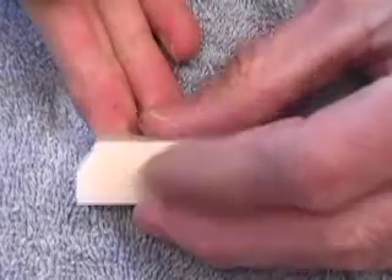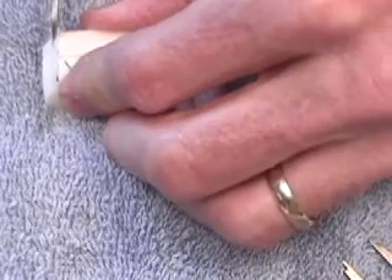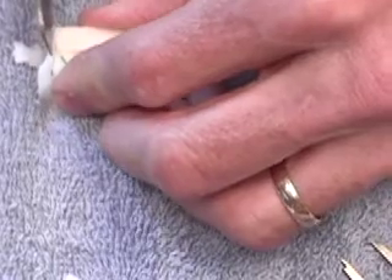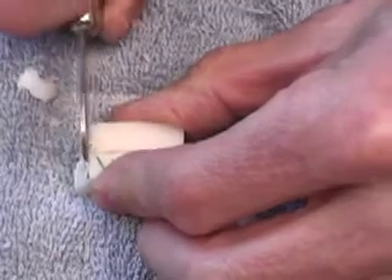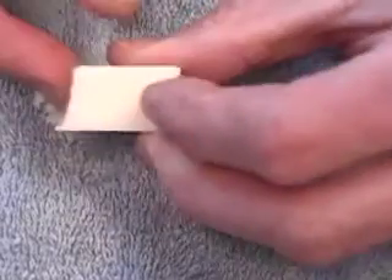There's our first pass — you'll get a feel for how much wax was removed. There goes our second pass. This time I'll be going a little bit more straight up and down, though still pointed slightly outward.